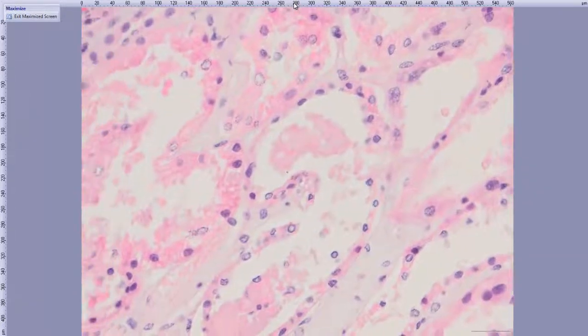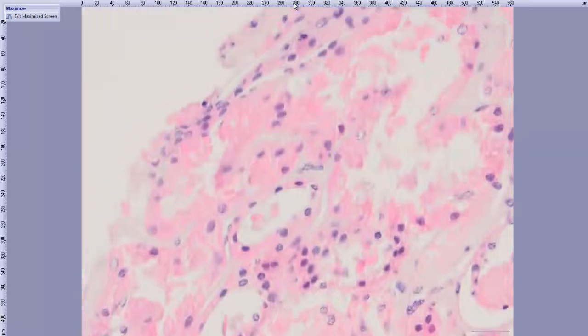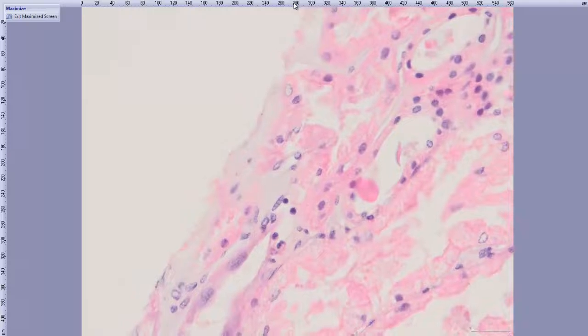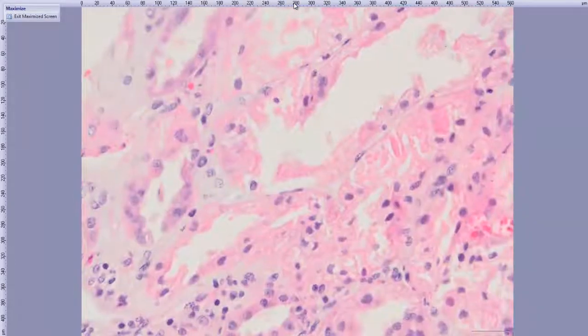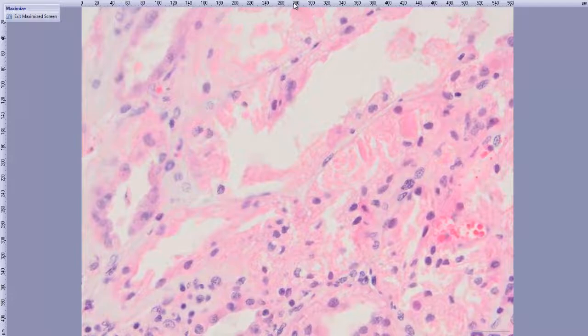There's acute tubular injury with granular casts, and within these casts and within the tubular epithelial cells, you can identify crystalline inclusion-like material. Especially when I've moved the micrometer here, you can make them out even better. See, there's a very big one over here, a crystalline one over here.